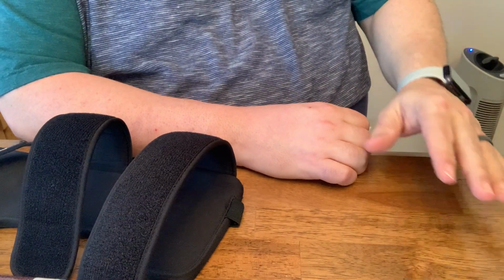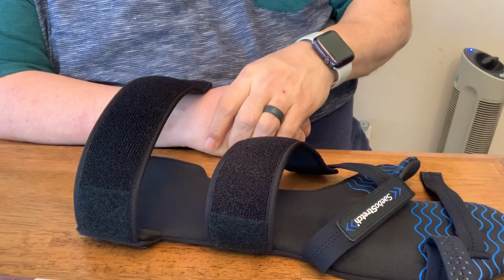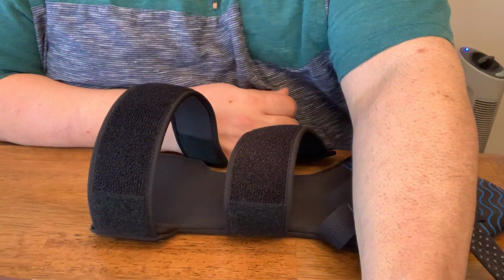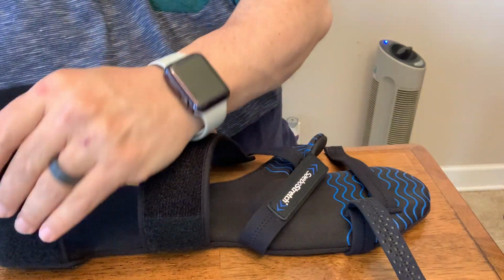All right, guys, I'm going to show you how to put this SaeboStretch on. They do have a video on how to do it, but I'm going to show you my method. Let me move the camera a little bit here. So I come to the edge of a table, okay? If you get a corner of a table, you can comfortably put it on.